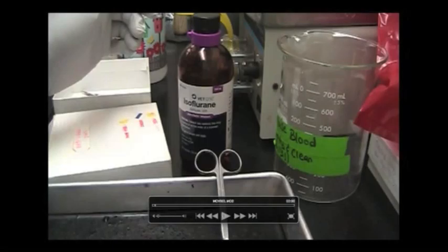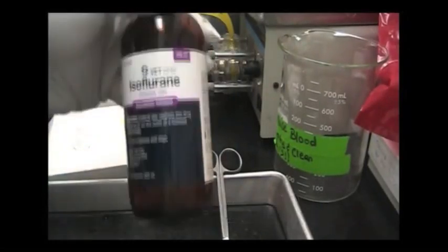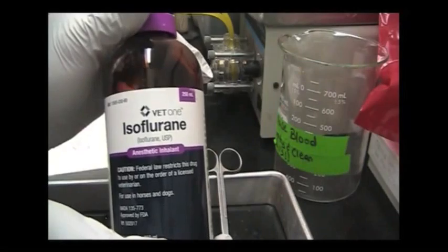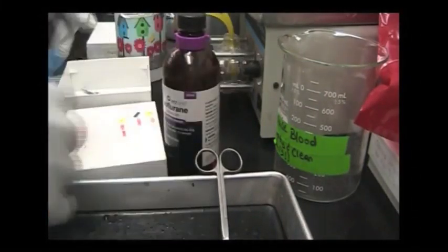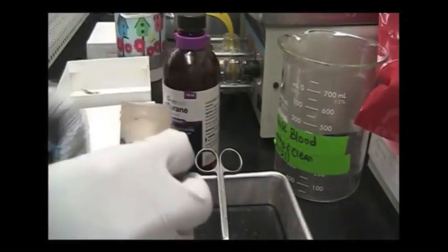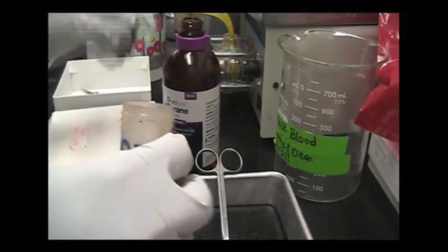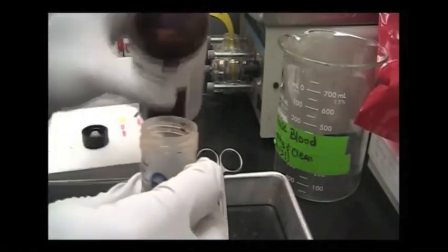What we will do is administer a small dose of this, and we're going to regulate this by pouring it out of the main stock container into an individual tube so that I can control the amount of isoflurane that the animal will inhale. It's kind of a rough estimate, but I pour probably about 2 or 3 drops into the 50 ml conical tube, which you see in front of me, and I'm screwing it in, and then make sure that everything is closed back up and in its proper place before I proceed.